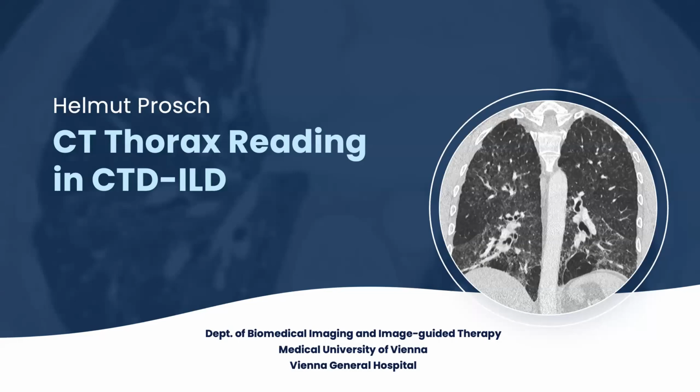This is meant to be a basic introduction into HRCT for rheumatologists. As I expect quite a variety of previous knowledge from your side, I have to start quite from the beginning, at the basics. As we move on, the cases will become more tricky, but it still will stay at a more basic level, just to make that clear from the beginning.